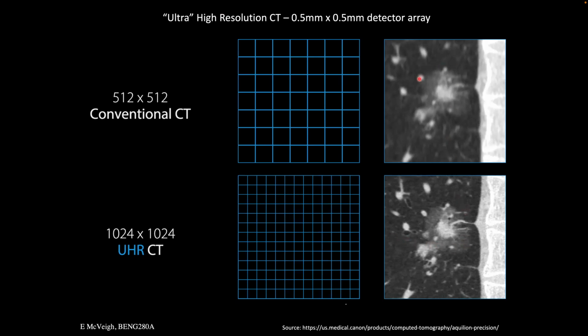So here's a conventional image of this exact plane, and this is the super high resolution one. You can see certain features like these airways, with even the wall of the airway highlighted, and it just doesn't even show up here. And these 2 airways there with their individual walls. There's substructure in this little nodule that we don't appreciate over here.